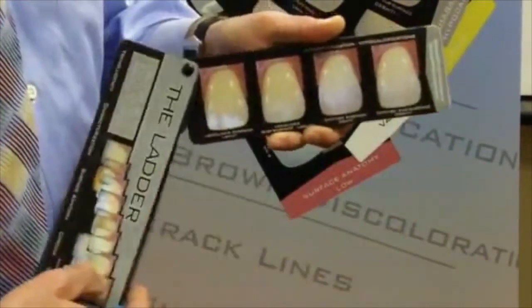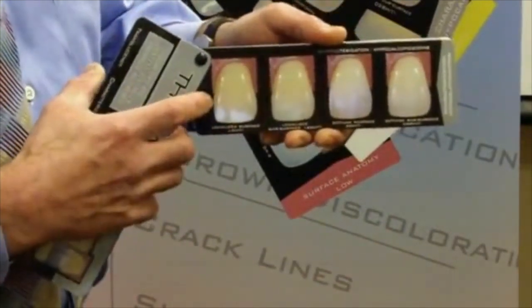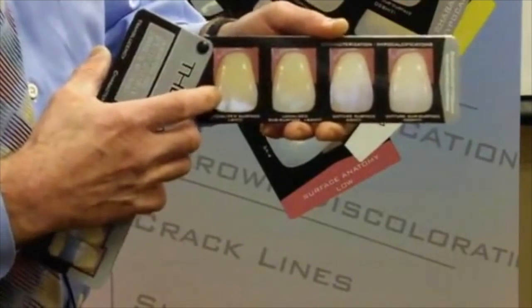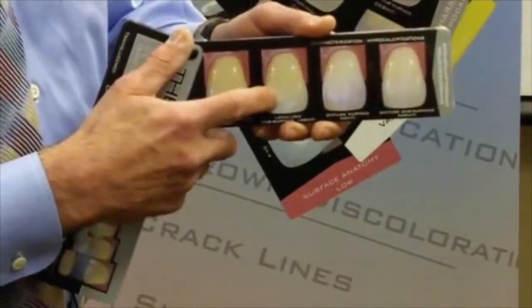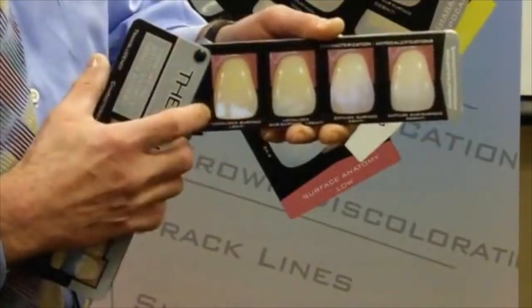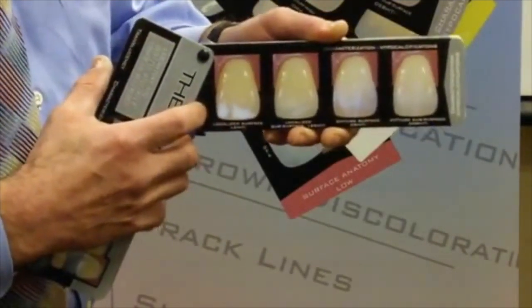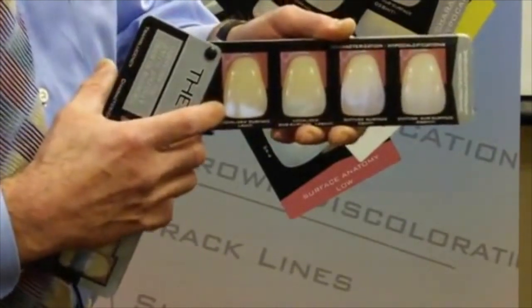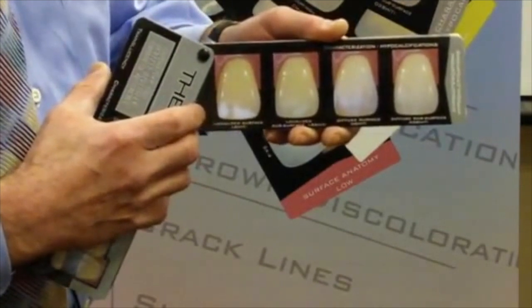I move to the characterization section, beginning with hypocalcifications. This page speaks to one of the defining factors of the ladder, which is an example of subsurface hypocalcification, extremely difficult to capture photographically. It can be captured, but not routinely. That's the digitization of the booklet. We've compensated for taking this to print.